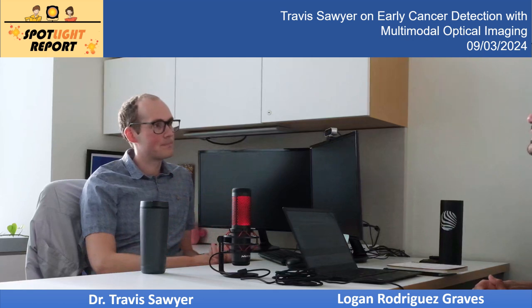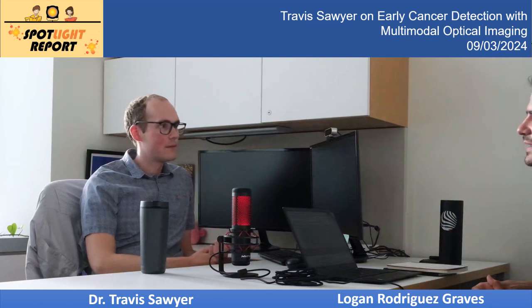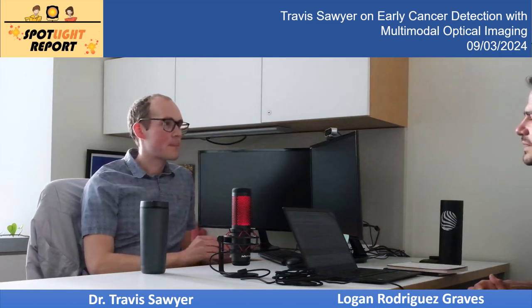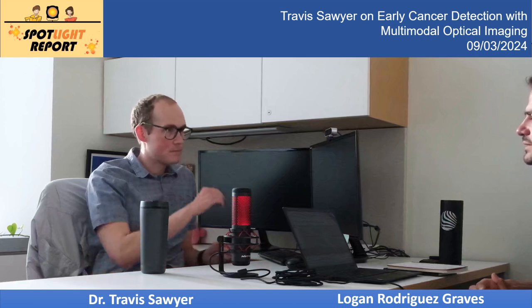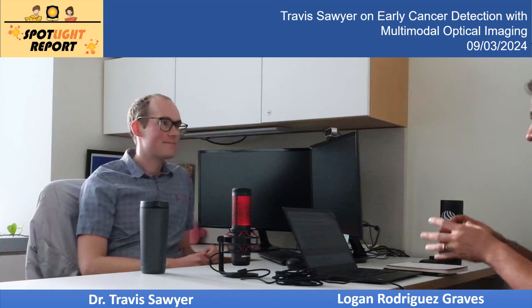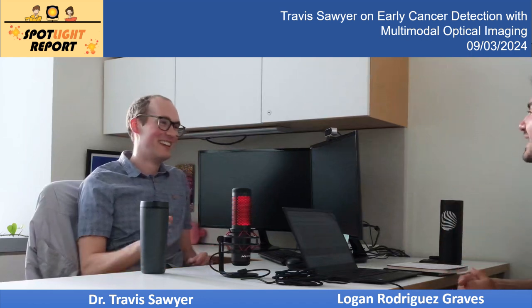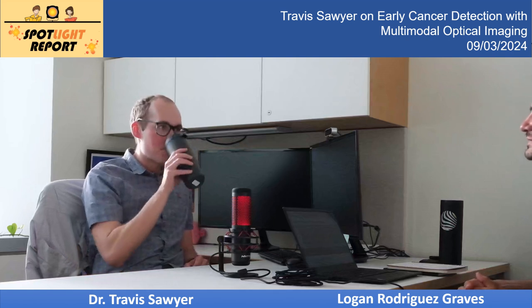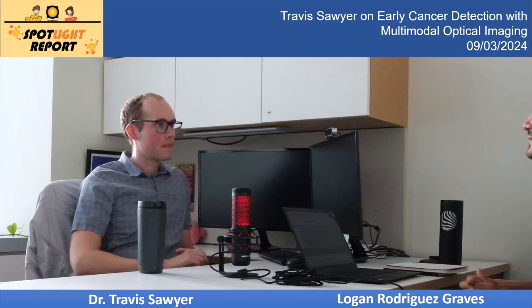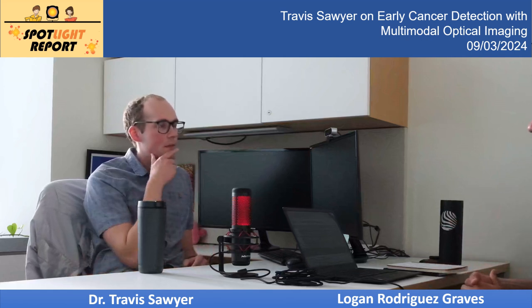Mm-hmm. And I guess I kind of glossed over this, and I definitely should not have, but biomedical optics are really hard to make. They're really small. I might have this wrong, but I want to say that in your prototype it fit into, or commonly they fit into, like a 3.2 millimeter diameter endoscope, and you're combining 3 modalities. You're fitting a lot of stuff in here, and so it's not only not a trivial optical design, engineering, and manufacturing task, it's a really hard one. So anyways, I just wanted to give proper credit where credit's due.